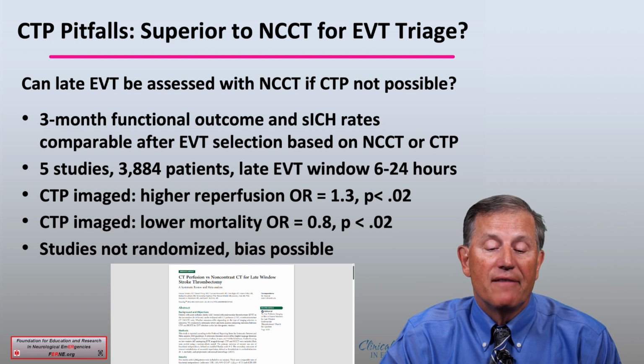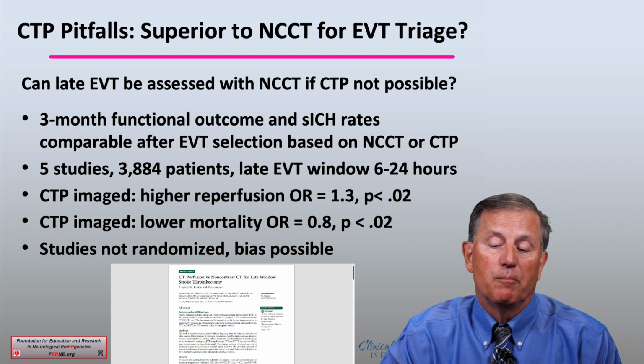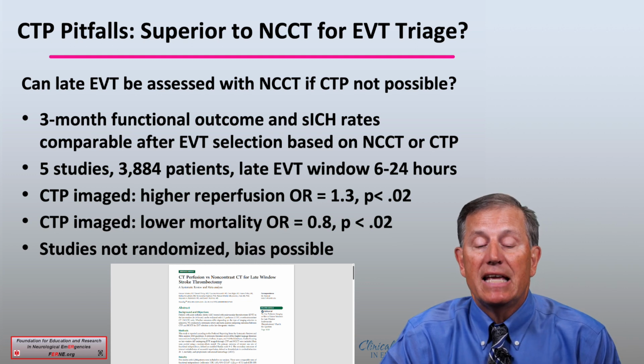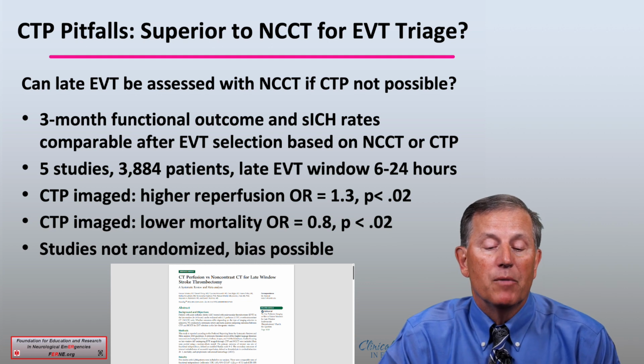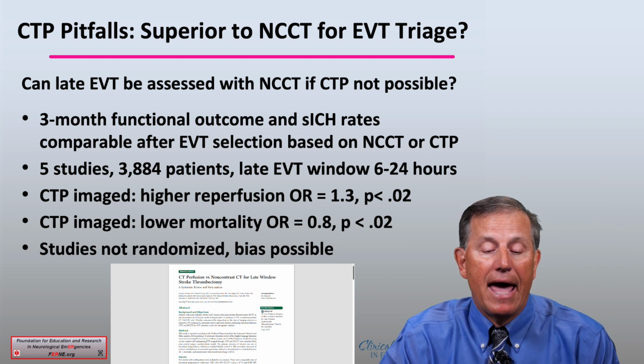It looked at 5 studies, almost 4,000 patients, and it looked at the late EVT window of 6 to 24 hours. And in fact, the CTP group did have higher reperfusion likelihood and a lower mortality.